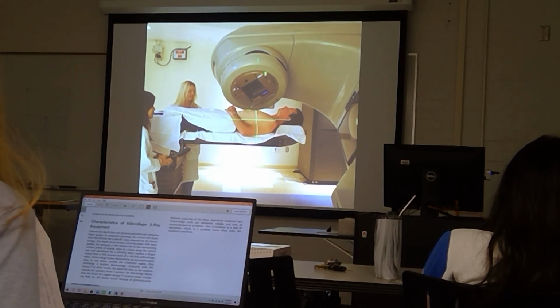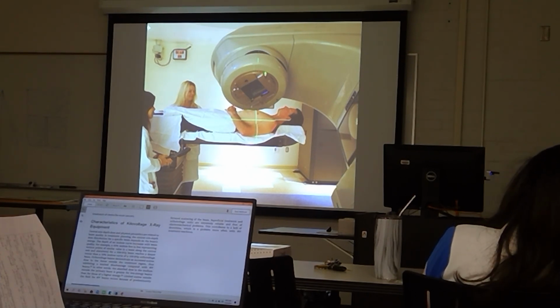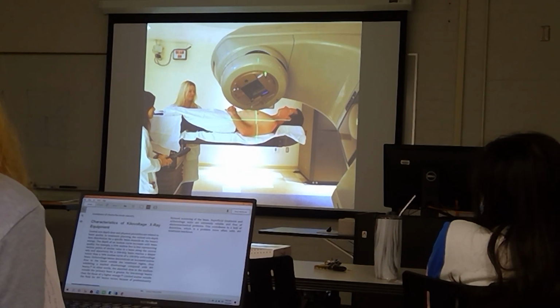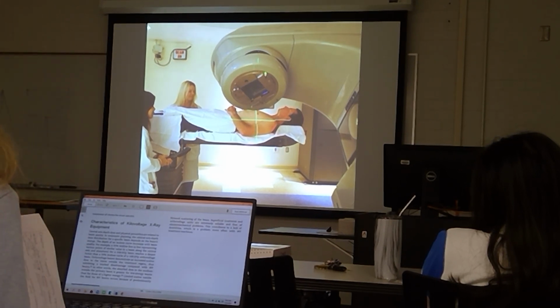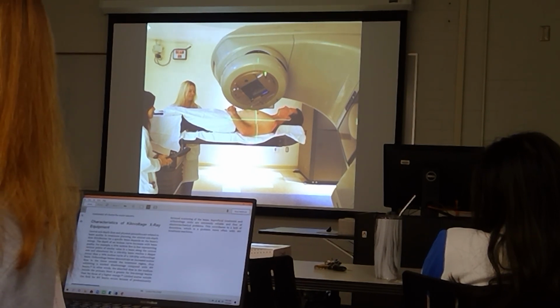So the back pointer is where this central axis comes out of the body. So if you have a beam coming in like so, the central axis is somewhere here, right? So what the back pointer does is it tells us where it exits the body.